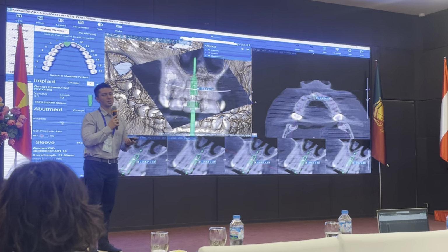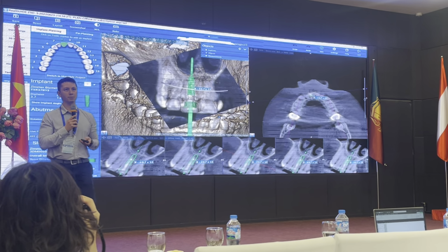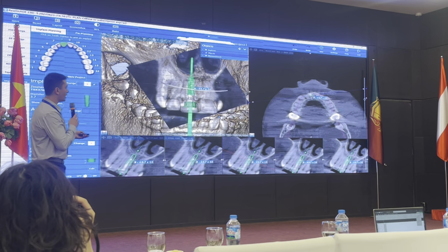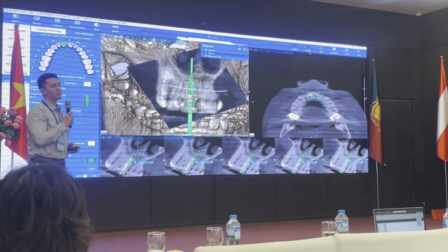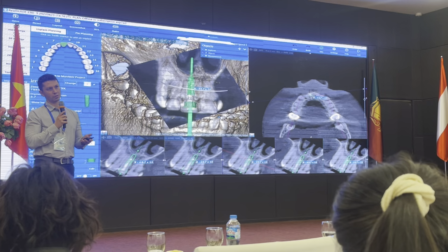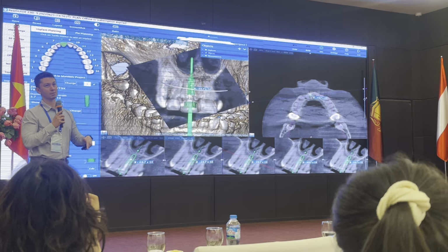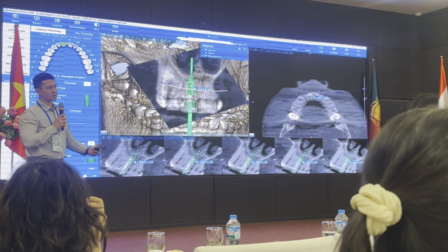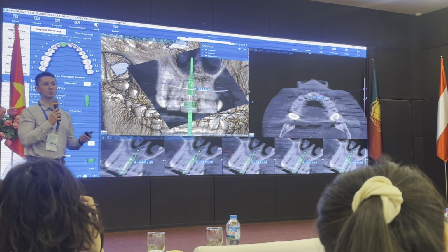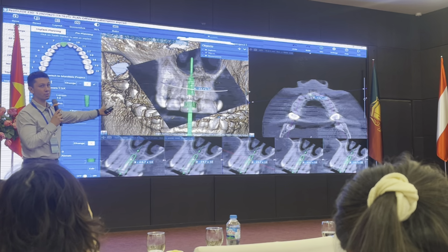Without that information, this is all just a shot in the dark, and we don't really know how deep to place it unless we do some research, measurement, and planning. Planning all this in advance makes the surgery day, which is a very stressful and important day, go much smoother, more efficiently, and stress-free. It makes dentistry even more fun to do, because dentistry can be very stressful if you're lost and there's a lot of pressure, and this is a front tooth, right?